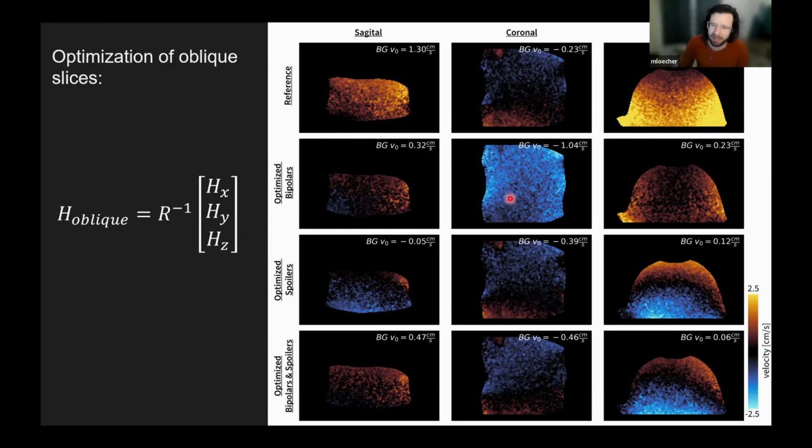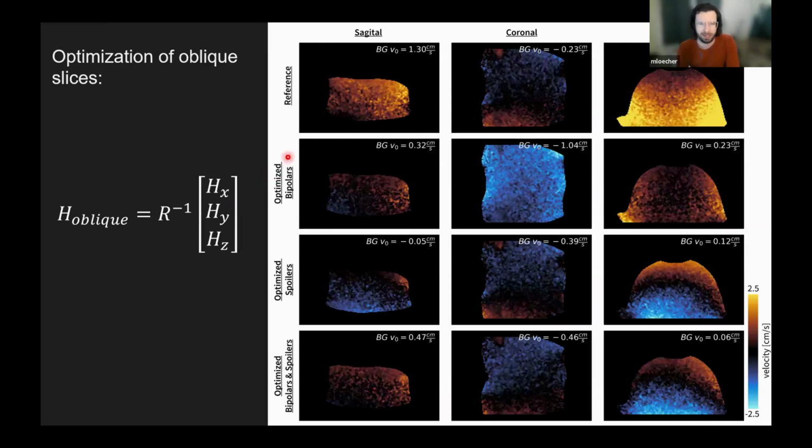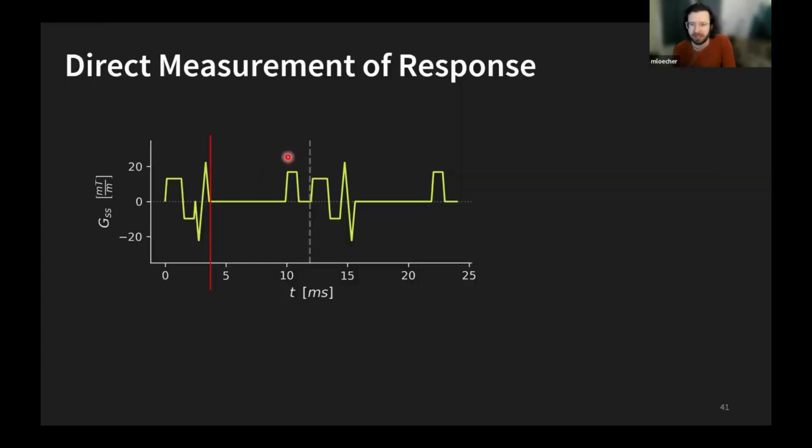Though I would say actually not completely similar. The X and Y GIRFs do seem to be a little bit worse at prediction, and we don't have an explanation for that, if that's well known or just something we're finding. But still, it's always been good enough to hit the thresholds that we care about. So that was just another aside on what we're doing with oblique slices.